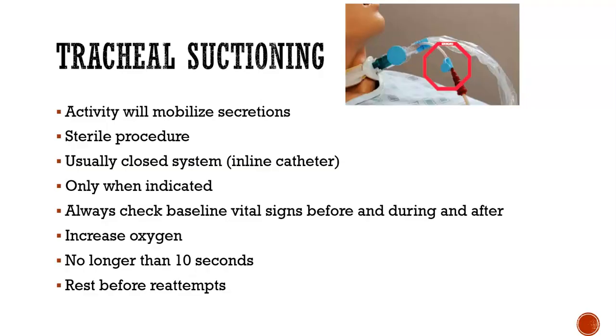It's still a sterile procedure, just like we talked about this summer. Still usually a closed system for an inline suction. We really only want to suction when necessary, because the more you suction, the more secretions you're going to make. And then we always want to check baseline vitals before, during, and after. Increase the oxygen if we need to. Don't suction more than 10 seconds, so we still want to hyperoxygenate them prior, and then rest before reattempt. Still, I wouldn't suction more than 3 times.